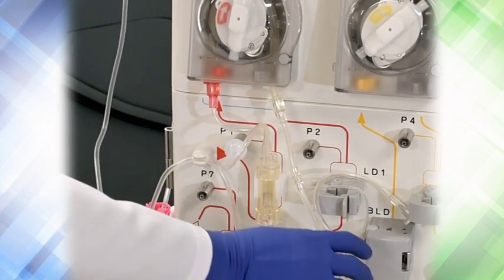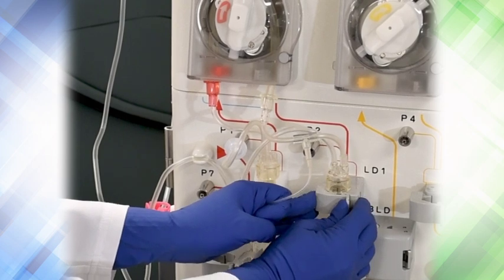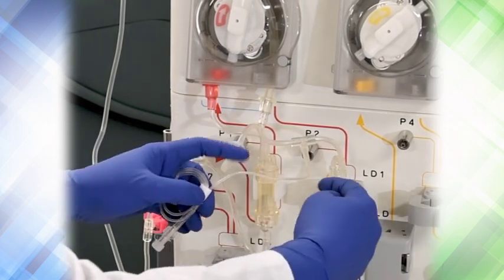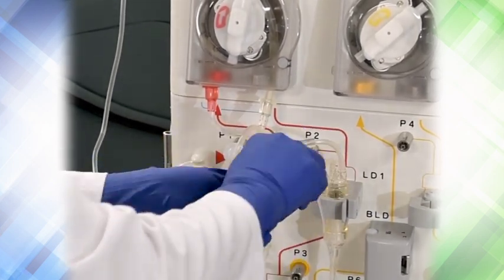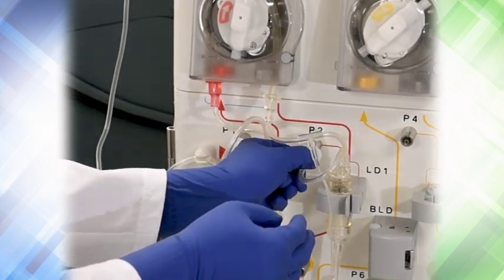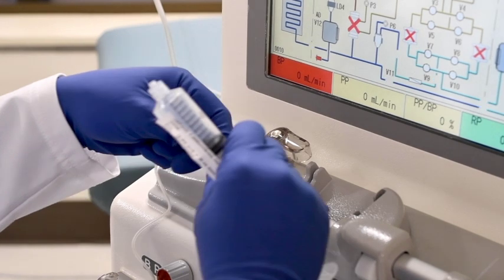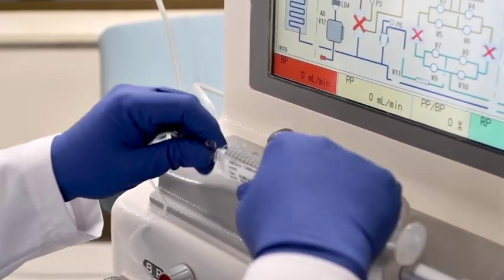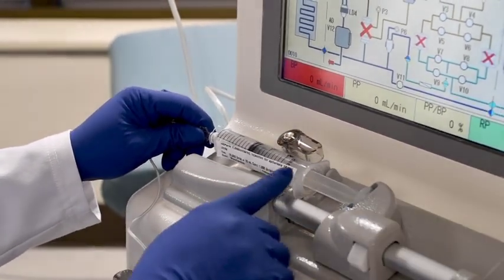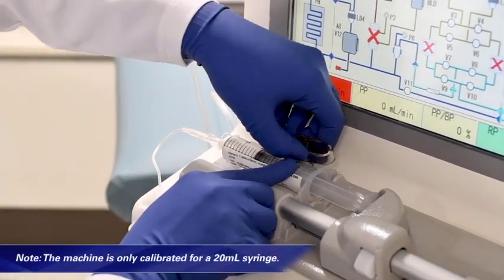Install tubing at the bottom inlet chamber into the guide next to P1. Install the blood pump outlet chamber into the level detector designated as LD1, ensuring the collar of the chamber sits flush to the level detector. Attach pressure line to P2. Fill a 20 mL syringe with heparin at 1,000 units/mL concentration. Install the syringe into the infusion pump with graduation marks facing upward, keeping the syringe plunger and collars properly seated. Note: the machine is only calibrated for a 20 mL syringe.